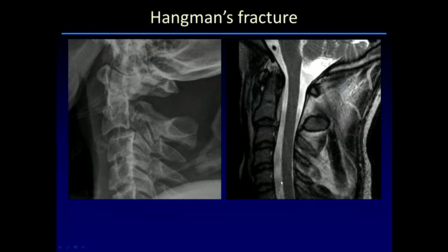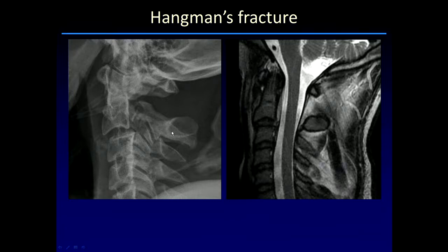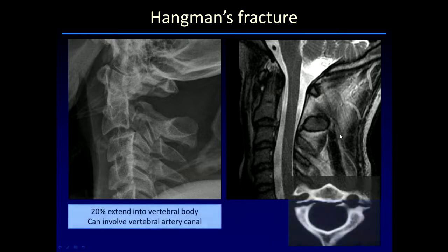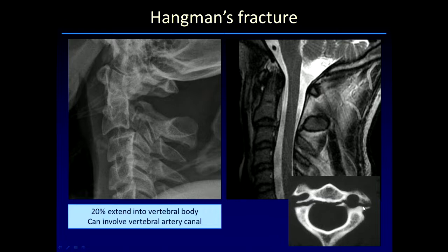Here's another example showing the typical anterolisthesis of C2, and also showing the retropulsion of the posterior arch. If we draw our spinal laminar line between C1 and C3, you can see the spinal laminar line of C2 lies posterior to that, with no encroachment on the spinal canal. However, it can have significant impact if there is associated vascular damage. About 20% of these fractures extend into the vertebral body, and a smaller percentage will traverse the vertebral artery canal, potentially resulting in dissection or rarely transection of the vertebral vessels.